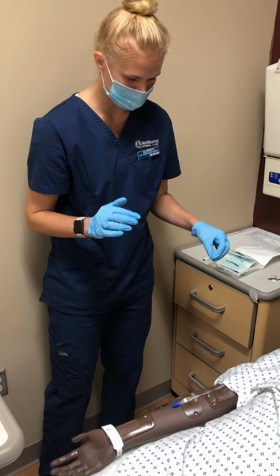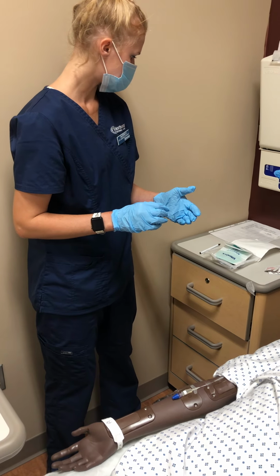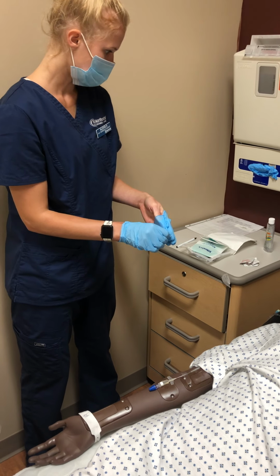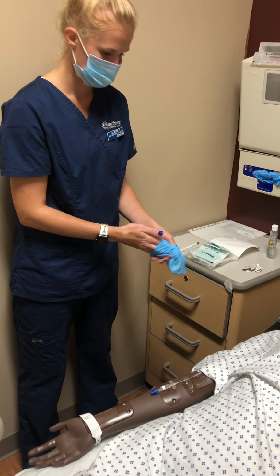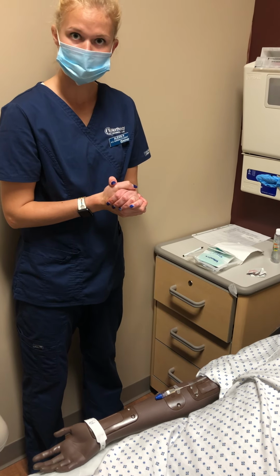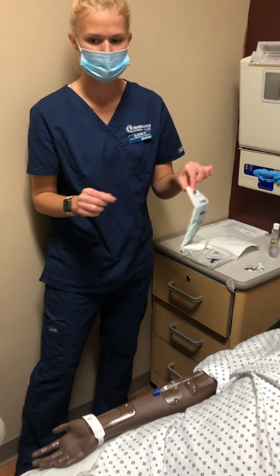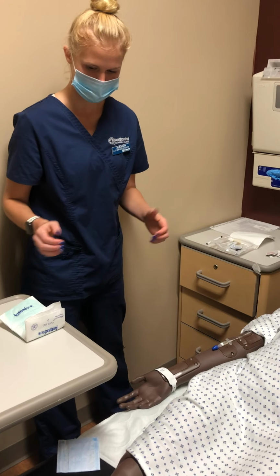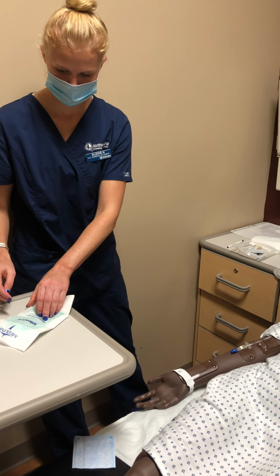I'm going to throw that away, take off my gloves, and wash my hands. Then I'm going to grab my sterile gloves. I would never turn my back to my sterile field, so that's why I'm staying nice and sterile.